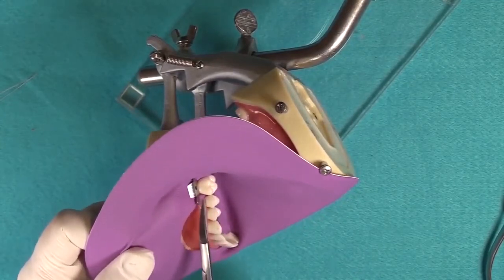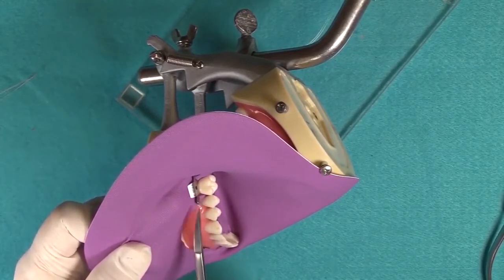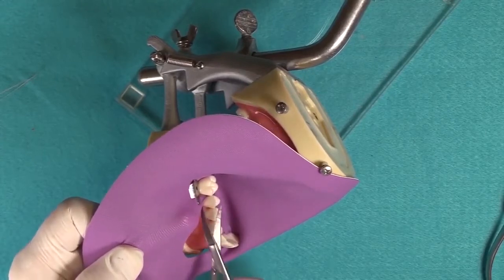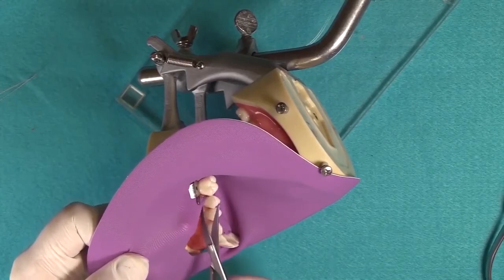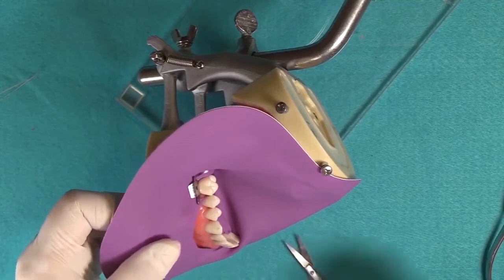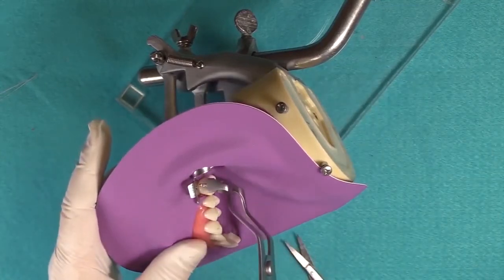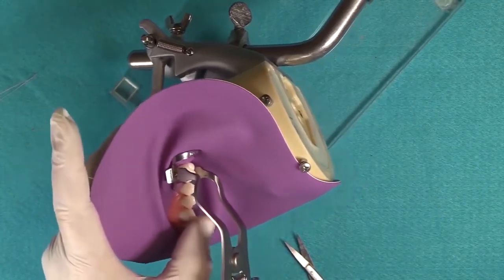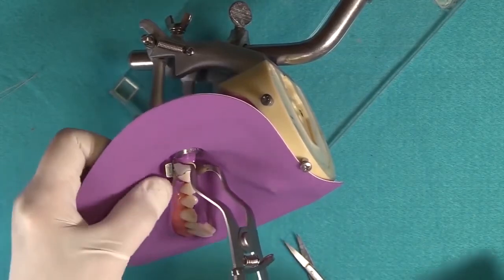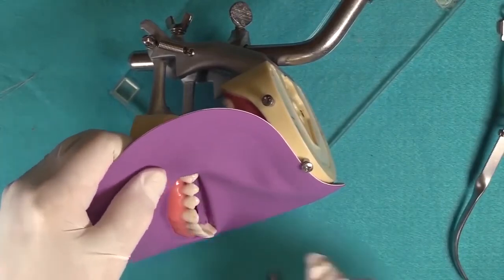Now, one thing about using the wing clamp, and this, Kevin, as you mentioned, is where the little projection can be a problem with your matrix systems. This also could be a problem when I'm trying to cut this off. So I try to keep the clamp on if at all possible. But if this is in the way, I'm forced to remove the retaining clamp. I try to take that off at the last minute, it's the last thing besides the frame. But if that's not possible, then I have to go in here and do it like that.